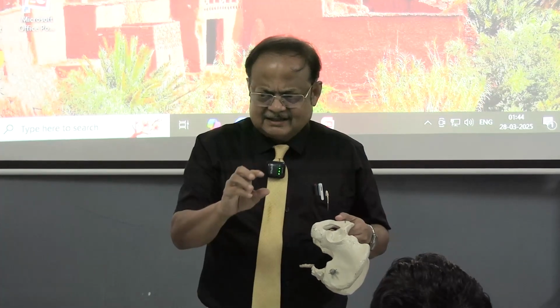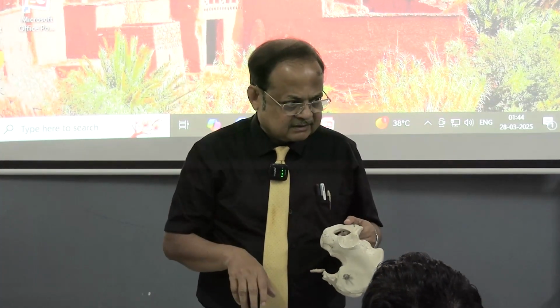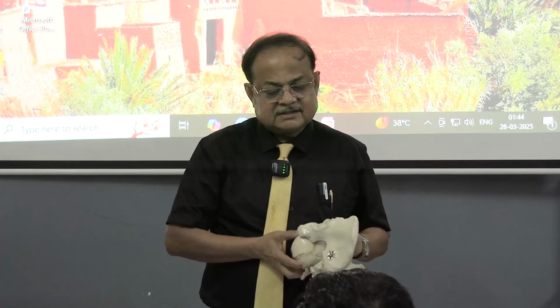So what are the functions of the forceps? The first is traction, and second is protection of the fetal head, and third is that you can rotate also to some extent, and compression to some extent. So these are the four important functions. One thing you must remember, these are the functions, and you must also remember the indications of the forceps.